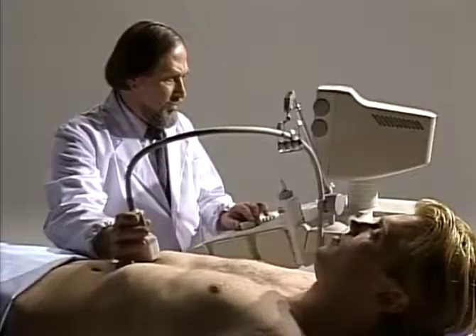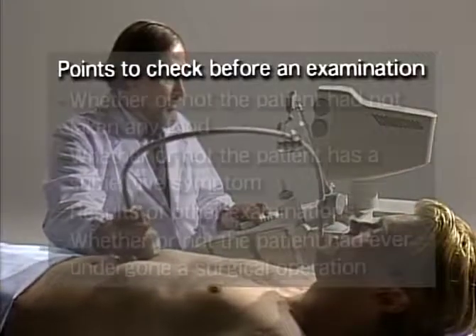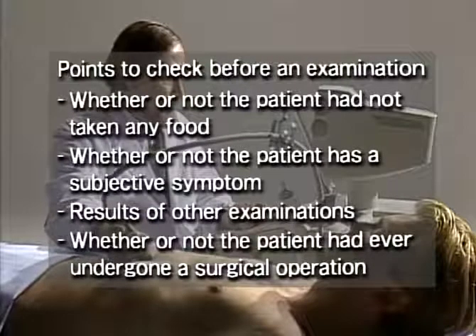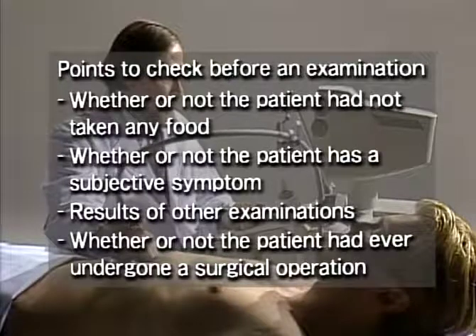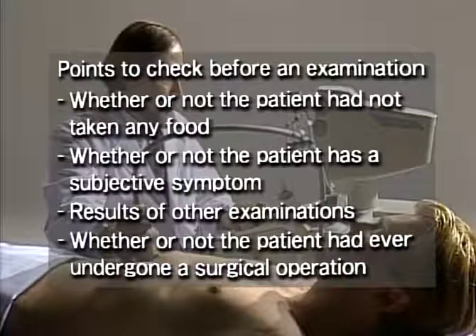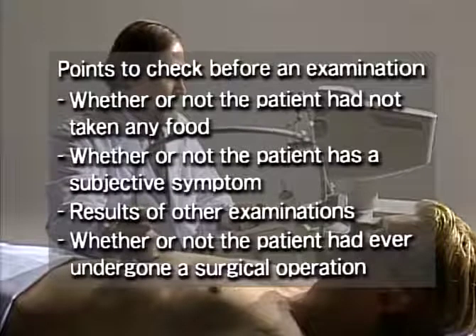Now, let's start the examination, but before that, we must ask the patient some questions. First of all, confirm that the patient is in fasting condition. Check if the patient experiences any subjective symptoms and also if the patient has previously undergone an examination or a surgical operation.